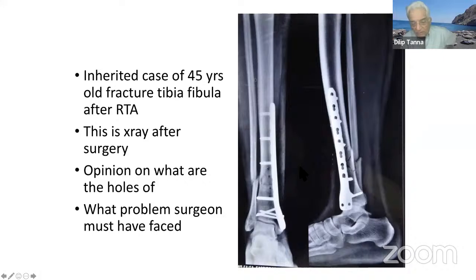See, all these things, we have talked about distal tibia. So basically now we'll finish distal tibia and we'll go to the ankle afterwards, either today or next time. So I think this ankle axis could have been corrected if the fibula was done properly. If it was straightened out, then it could not have gone there. Yes. Agreed.